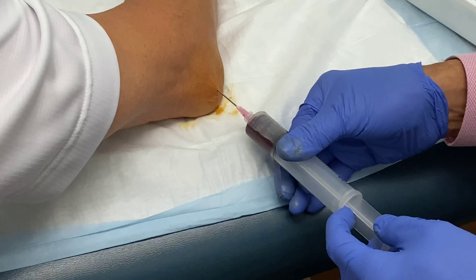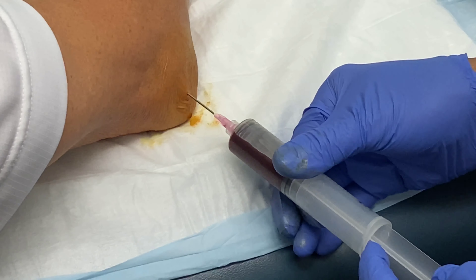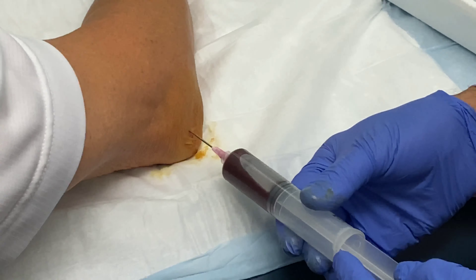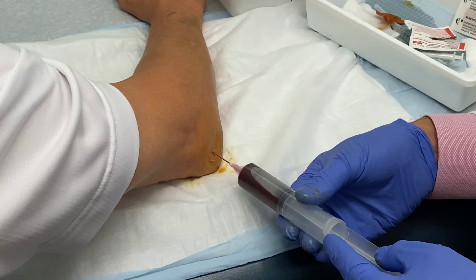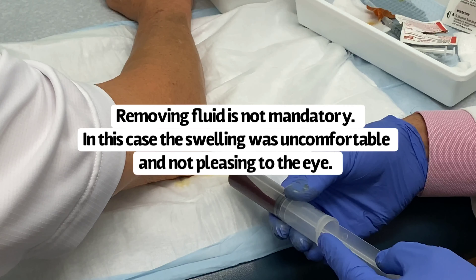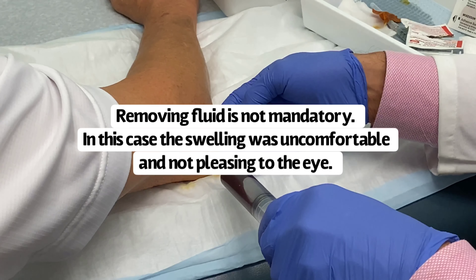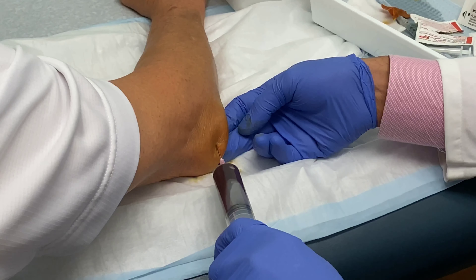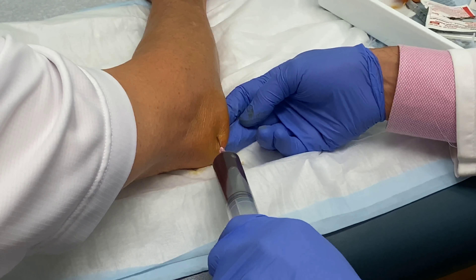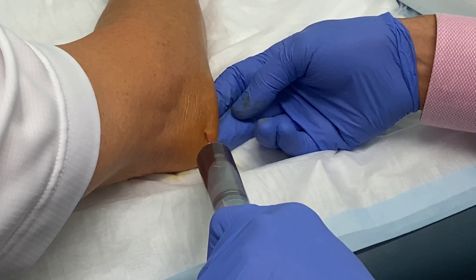This is traumatic bursitis. I'm aspirating for two reasons: number one, for comfort, and number two, it's not unusual for these bloody bursal collections to become infected — bacteria seem to like blood — so they often become infected. I'm taking the fluid out and finding another little pocket.